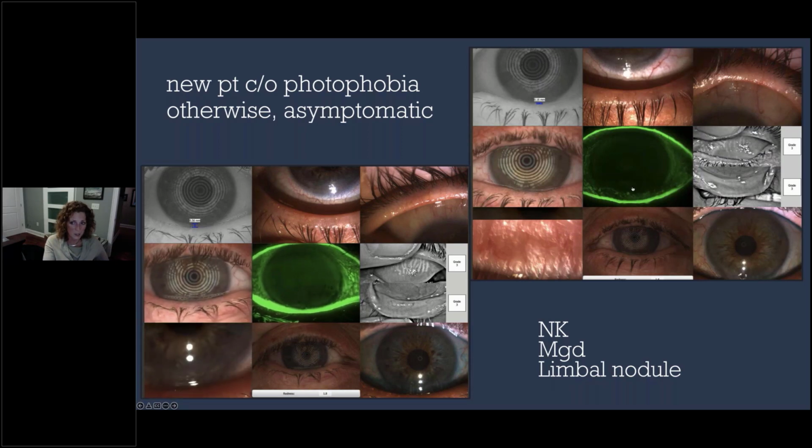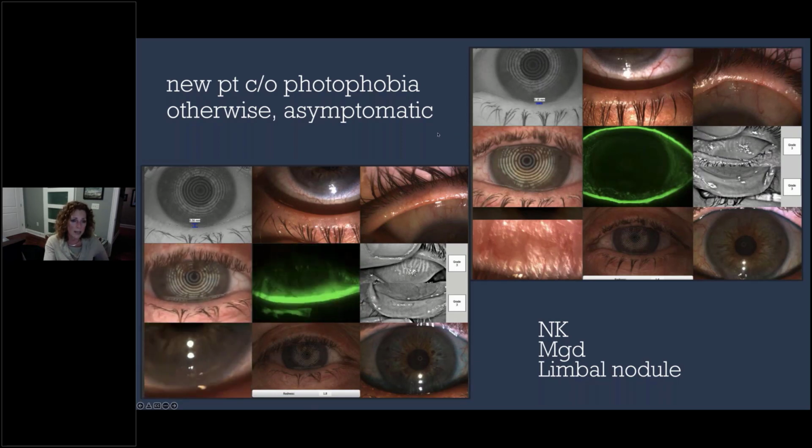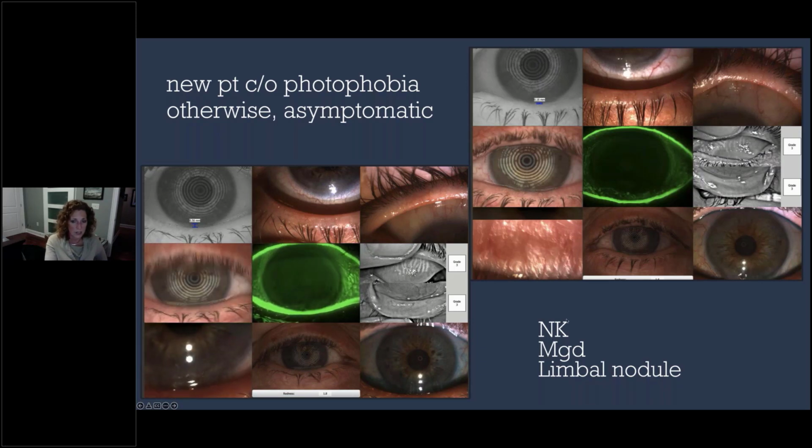And this is neovascularization, it's nodular, and pretty much no feeling when I did the corneal sensitivity test. So make sure if you're bringing them back for a full dry eye eval, take your little cotton wisp and check their corneal sensation, because a lot of these patients, you cannot judge by their symptoms in any way, shape, or form because their nerves are not sending the message to tell them that they should be in pain.